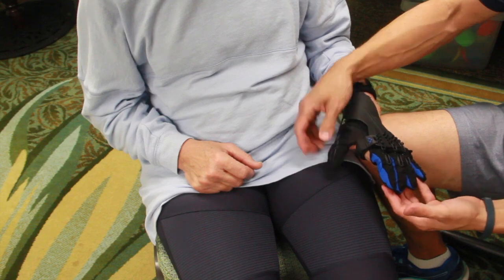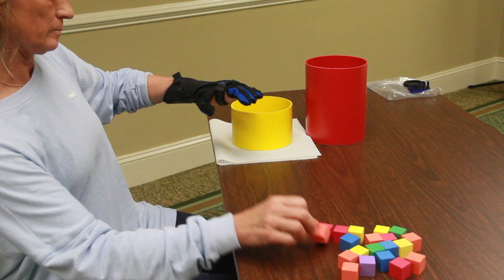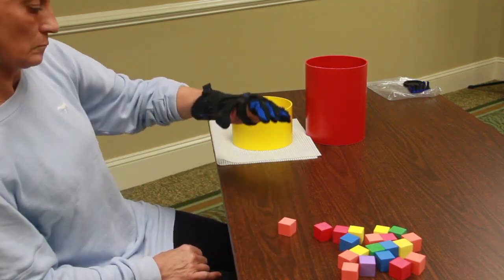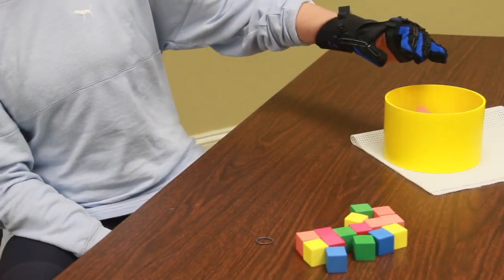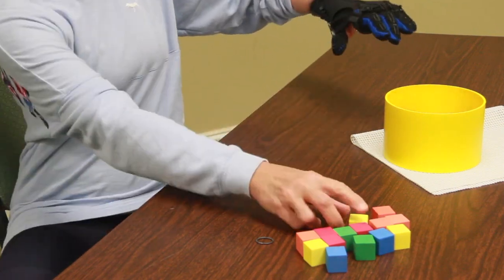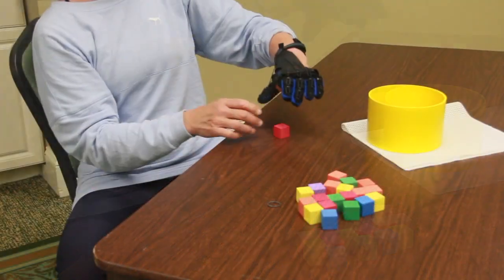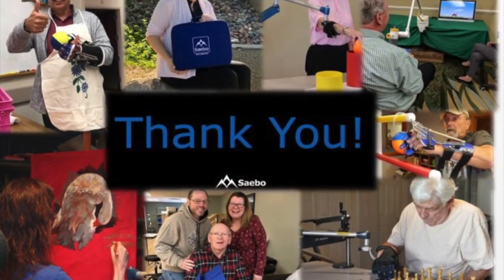So now Susan's ready to work on her grasping and releasing. So here she is picking up some blocks. Remember, when we first started this exercise, she was unable to pick up any of the blocks without the glove. Minutes later, with the glove on, you can see that she's able to pinch and release the various blocks because she has the tensioners needed to assist with not only positioning her hand in the right position for grasp, but also releasing.